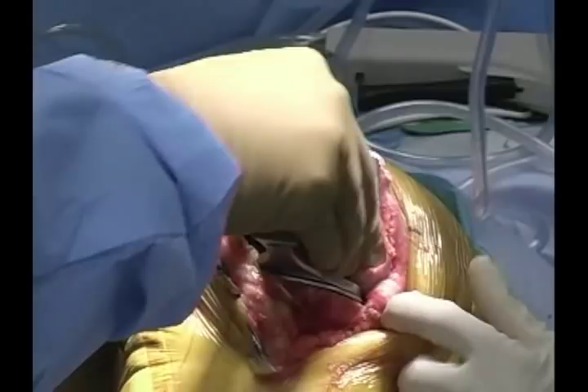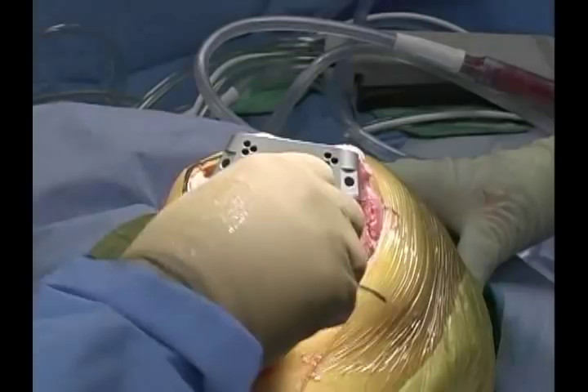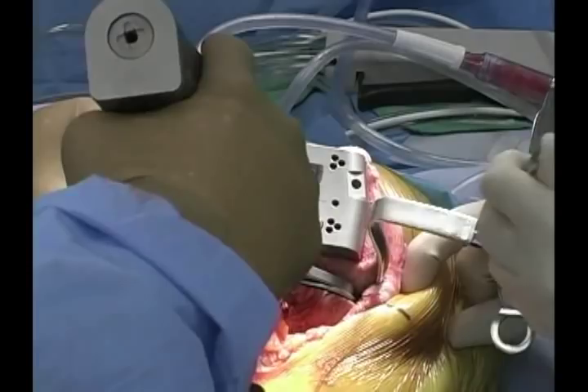I'm fairly satisfied with the translation of the block. If it was too tight, I would loosen the knob and translate the block anteriorly. If too loose, I'd loosen the knob, translate it posteriorly, lock it in place, and reinsert the positioner. In this case, the tension on the collaterals and the location of the block are appropriate. The collateral ligaments have set the rotation and translation, so we'll pin this block in place.